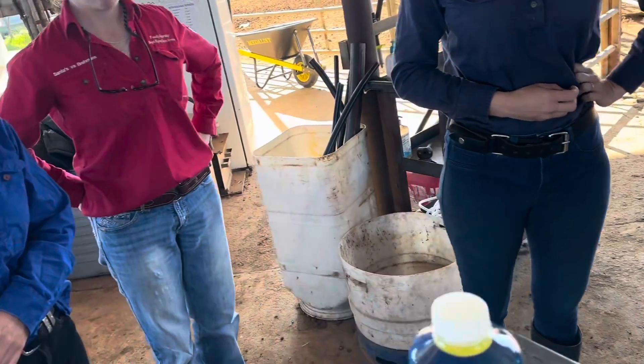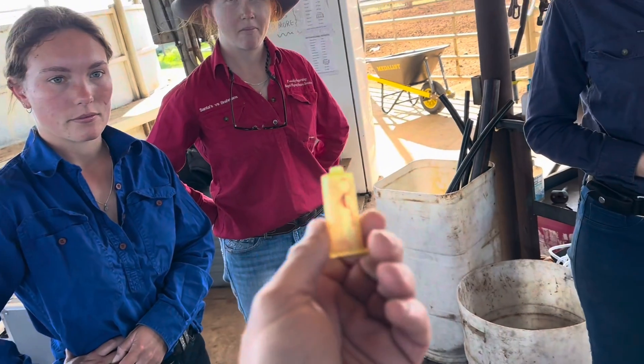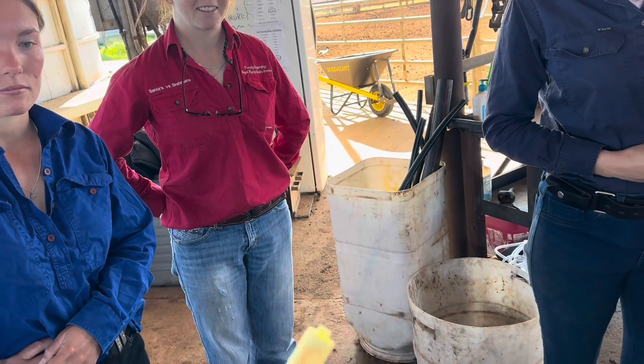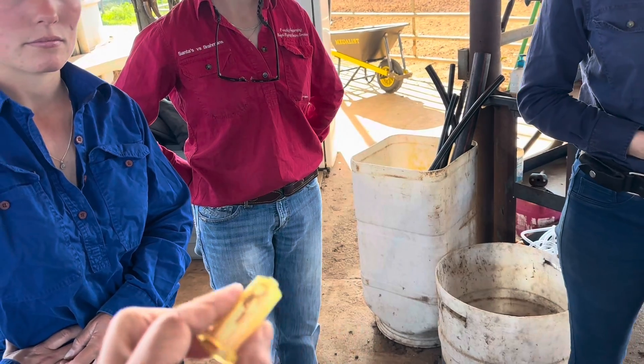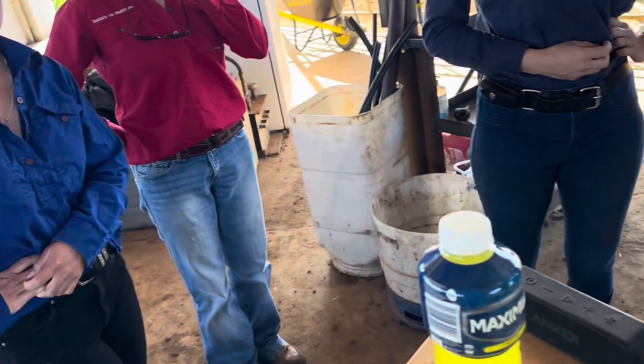These are vacutainer hubs. When you donate blood, they used to use these in human healthcare a fair bit, but now they use stuff that's a bit safer so people don't actually get needle sticks — a lot fancier. But this is what they used to use, and they still use them a fair bit in human healthcare. And these are double-ended needles.